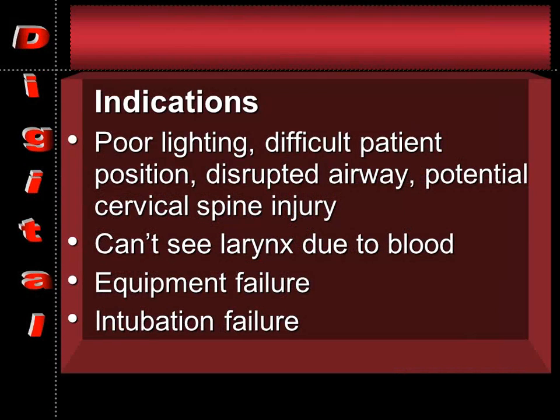And with this, since I'm right-handed, I put the right hand in from the patient's left side. So I'm looking at their feet. Put your hand into the mouth, and you can actually feel the glottis, epiglottis. Lift up on that, and then take a 6.0 tube, 7.0 tube, whatever, and slide it right between your fingers. And as the tip gets down to the very end, using the middle finger, all you do is flip the tip up. It's also good if you're using the tube that has the pull string, like for nasal intubations, the Endotrol. So you can pull it up with one side and help, it takes a little bit of work, but doing both at the same time really gets that tip up there so you can push it through.